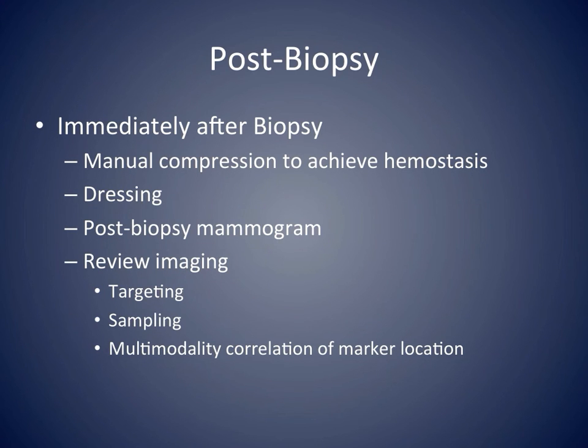Immediately after the biopsy, the patient is transferred to a stretcher and manual compression is applied over the biopsy site to achieve hemostasis. After the patient has recovered and a dressing is applied over the biopsy site, the patient is escorted to the mammo suite for a post-biopsy mammogram.